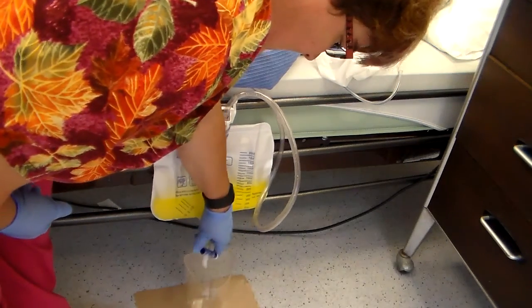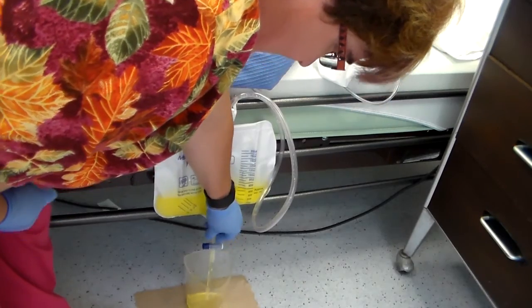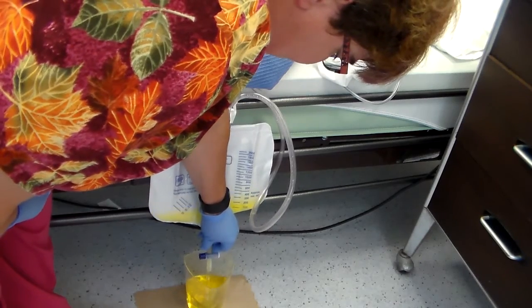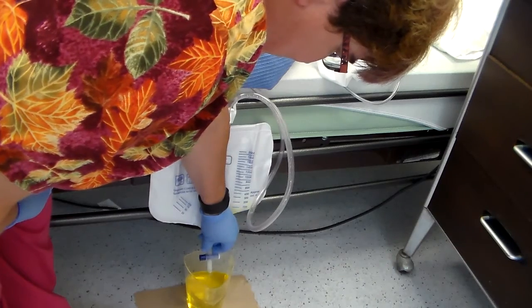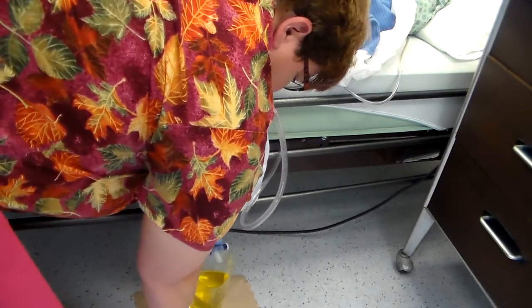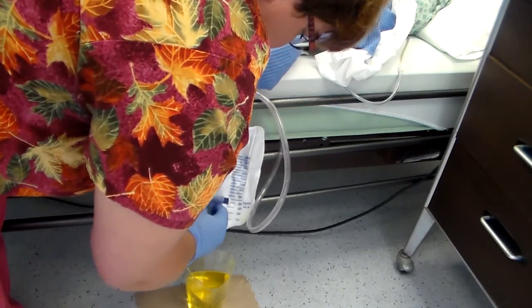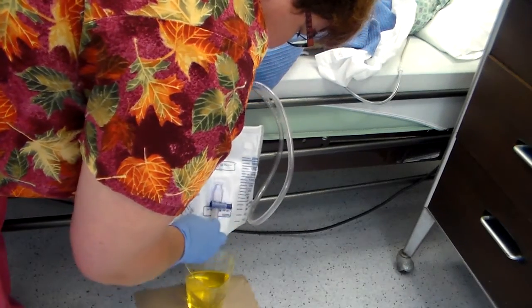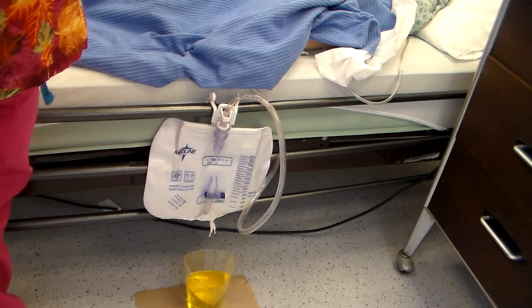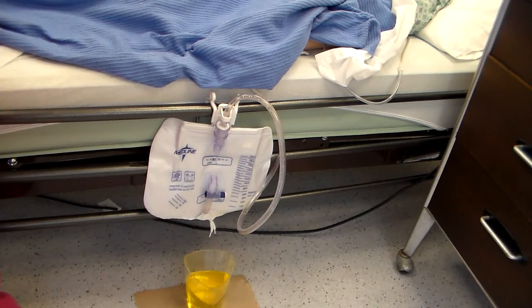This one's simple. You just push the white button, like that, and you see the urine just comes right out. So we're going to empty it, and then we're going to push this closed. We're going to take our alcohol pad and wipe the end of our hose, and then stick it back into our housing unit. Why do we wipe the end of the hose? Well, first of all, urine smells, and after it sits there a while, ew. And we just want to cut down on the germs, so always wipe that off.